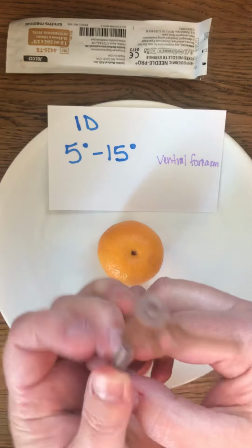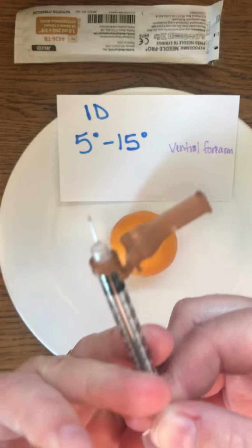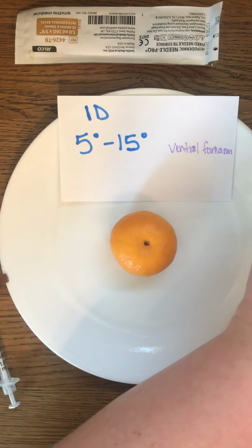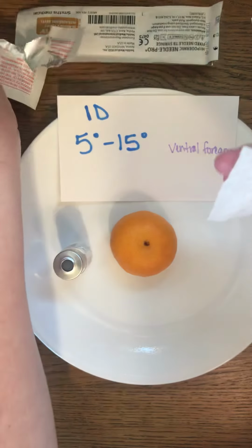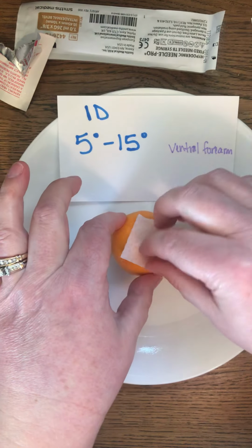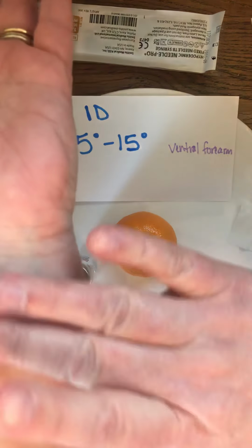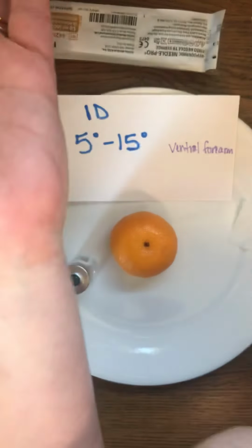It's a lot harder to see in such a small syringe like we have here, but you'll want to take a look at that and make sure that you have that correct when you administer, especially an intradermal. So I'm going to draw up some of my solution. We're going to just do some practice here. Like always, we want to have clean hands. We're always going to want to clean, and then we'll take a new one. We're going to pretend, and we're also going to clean the skin. Intradermal injections are almost always done on the ventral forearm. This is the dorsal. Think of a dorsal fin of a whale. This is going to be the ventral.